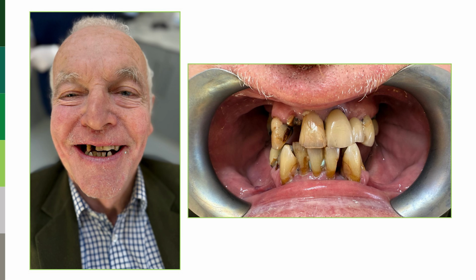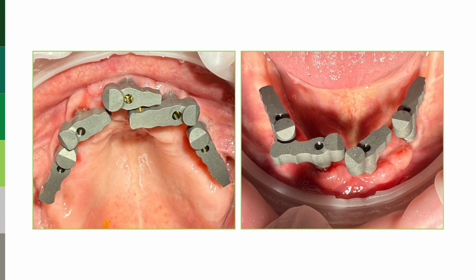This is a dual arch reconstruction, and this particular gentleman had his temporary bridges in place, and as usual everything is healed, and we're at approximately 16 weeks from his date of surgery. He's pretty happy with his temporaries in terms of bite, vertical and appearance. He has come in for one single appointment where we have used the ArchBridge workflow, so Grammetry ArchBridge.